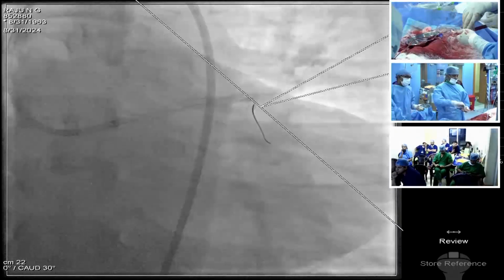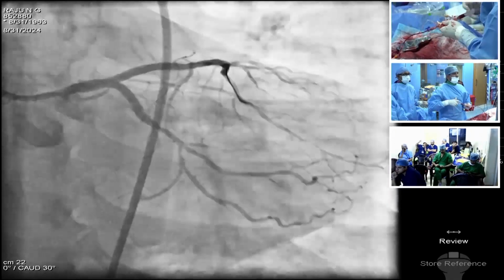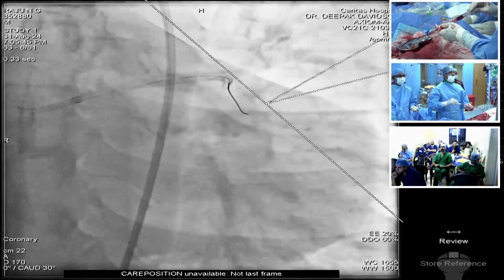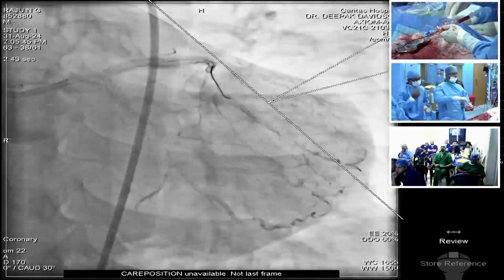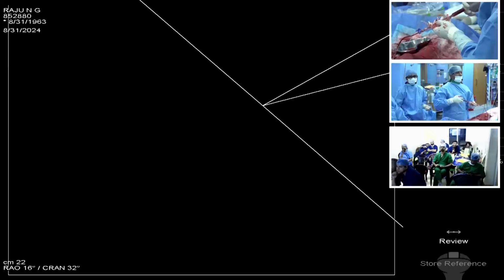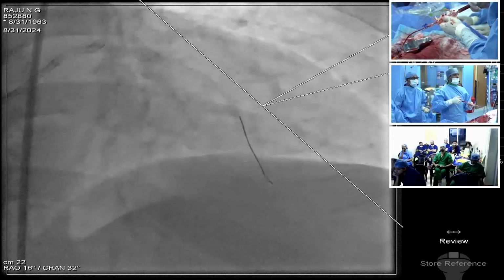Switch it. Angiographically, it's quite gratifying, but in the cranial view, it may not be gratifying. It might be an eccentric looking confluence.